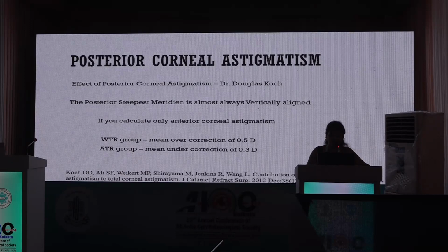Important concept to remember here is the posterior corneal astigmatism to be taken into consideration. So when you're doing the keratometry, it is giving you only the anterior curvature. But the posterior corneal curvature also plays a role in the total corneal astigmatism that is there.